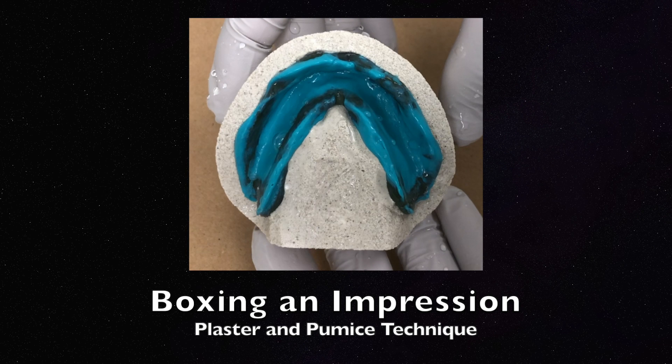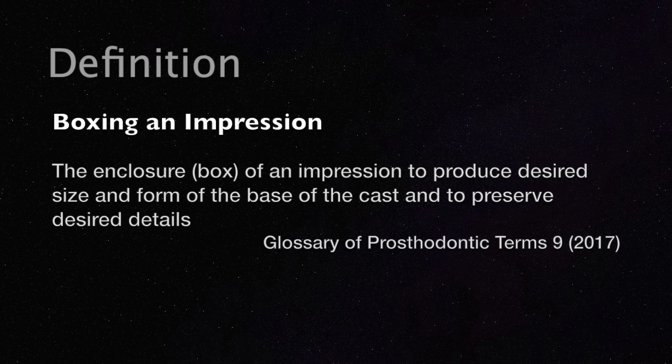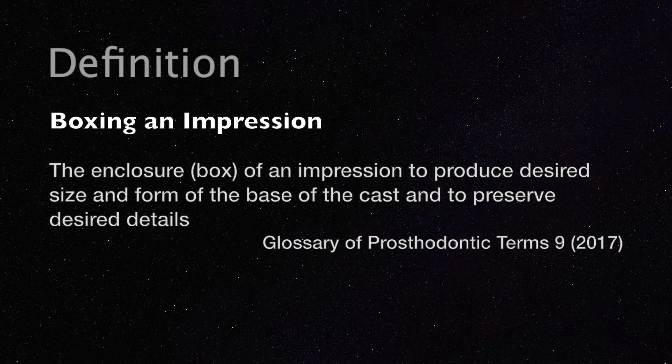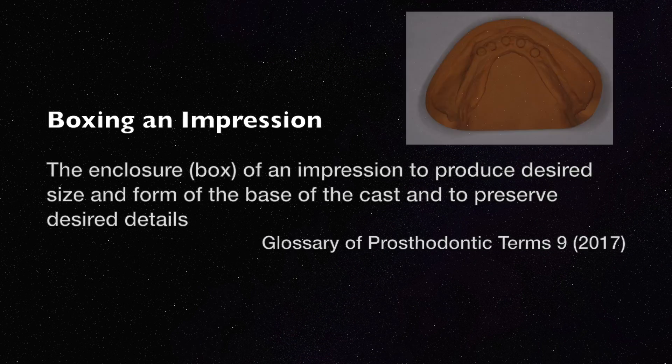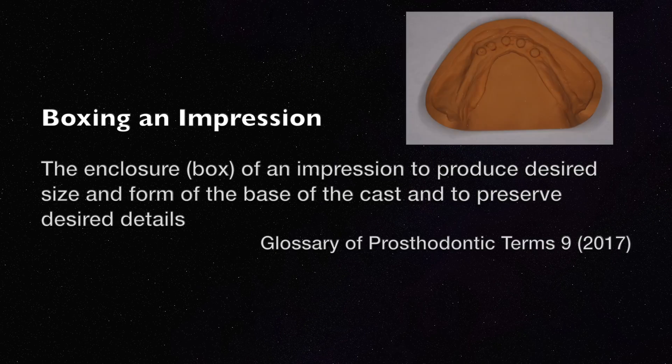The objective of this video is to demonstrate the boxing of a complete denture impression using the plaster and pumice technique. The boxing of an impression is defined as the enclosure of an impression to produce the desired size and form of the base of the cast and to preserve desired details.